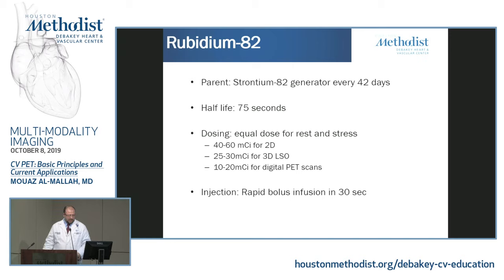So these are the doses. If you are using a 2D system, you have to do 40 to 60, and 25 to 30 for a 3D system. And we've imaged some patients on our digital one with even 10 millicuries, and we have beautiful images despite that. The injection rate is over 30 seconds. The nice thing is that the whole study is done in 20 minutes.